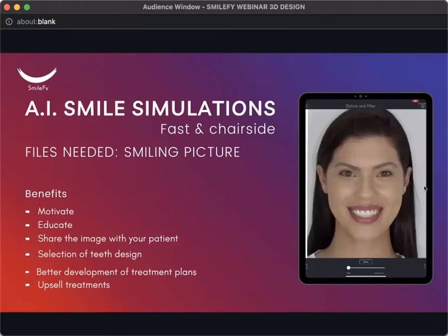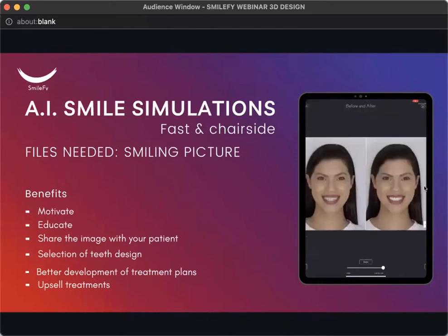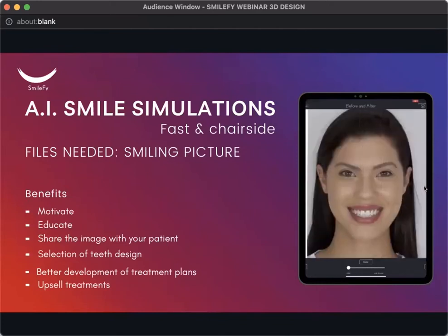Just imagine yourself going into a place where you cannot see what you're purchasing. That's exactly how we conduct our treatment plans today in our practices. And elevating that type of communication with your patient will definitely bring your consultations to the next level.